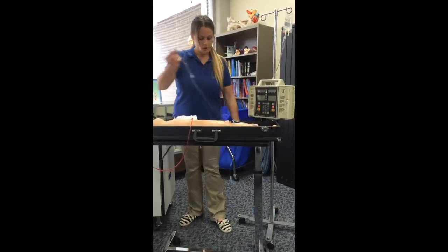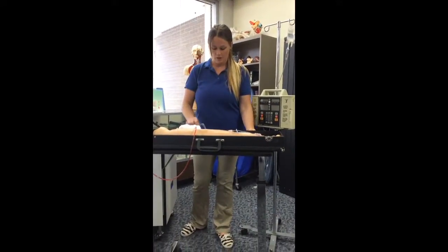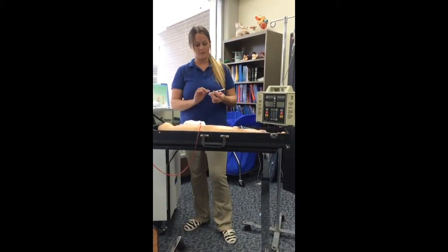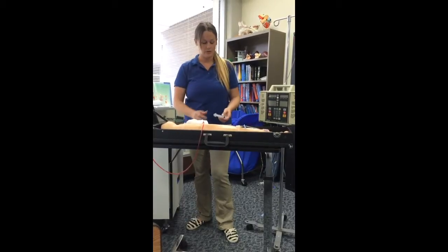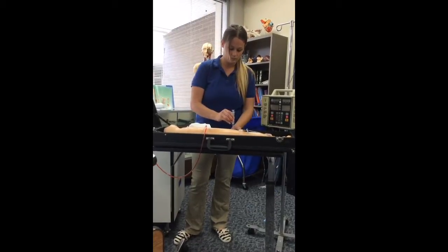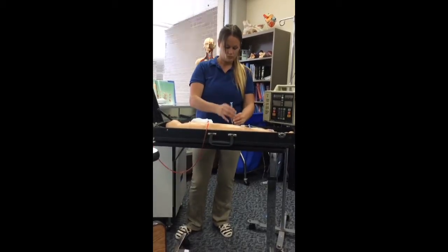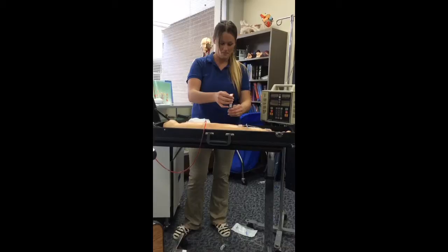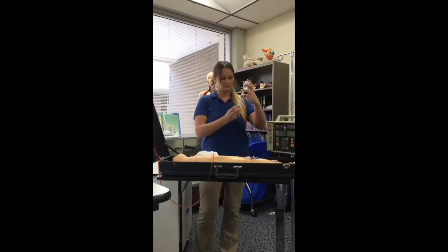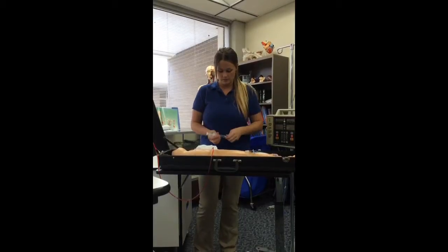Then I'm going to look over the MAR, make sure that I have everything correct. I have the medication. Now I need to draw up, out of my 10 ml syringe, 6 ml of saline. This is going to be used for multiple purposes, multiple uses.